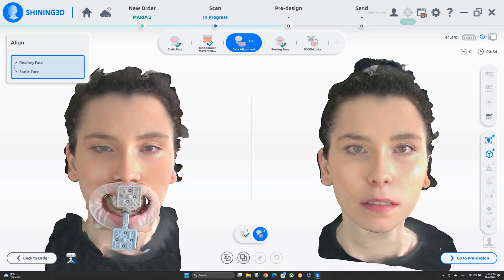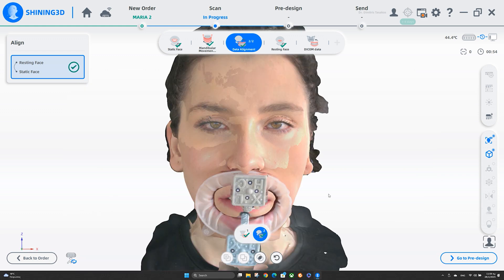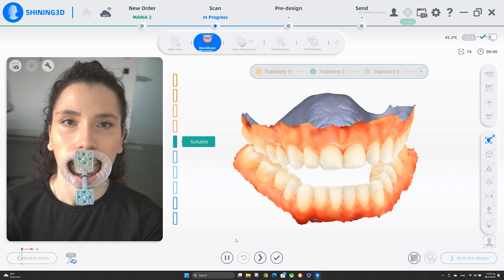We have completed our Geomotion recordings with our facial scanner. Besides having the 3D of our patient's face, which is very useful for 3D smile design and the mounting procedure on the virtual articulator, we can have the mandibular trajectories. There are 3 modules inside the MetiSmile software about the Geomotion. The first module is the mandibular trajectories.